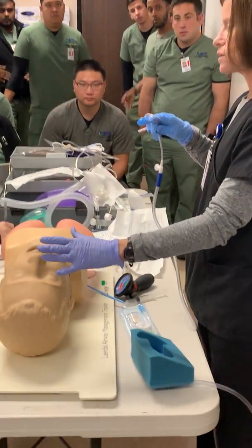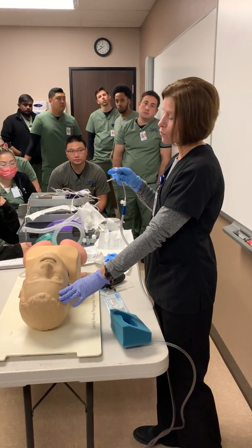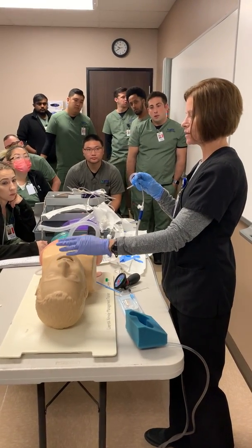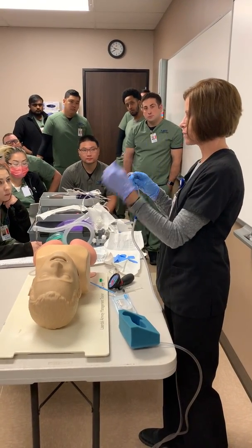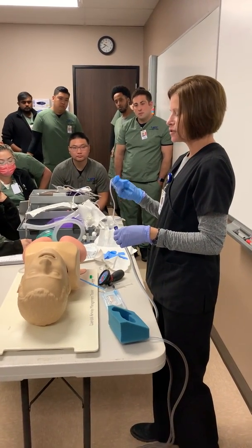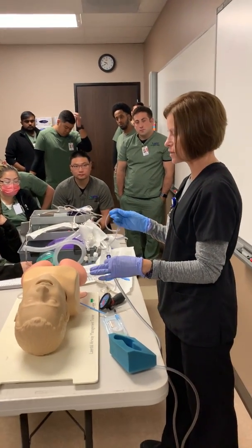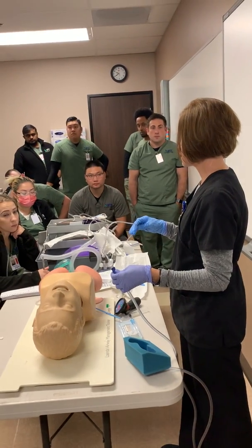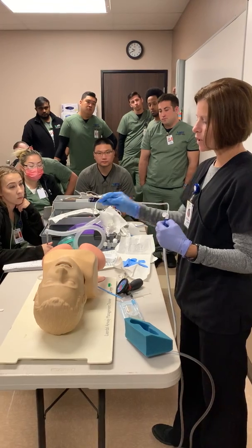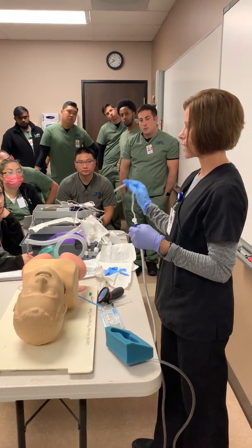Pre-oxygenation. So in the ICU, a lot of times they do the bag, the ambu bag. On the floors, a lot of times we don't. If a patient's wearing a nasal cannula, you'll see them put the nasal cannula in their mouth so that they're still getting some oxygen. Should you have an ambu bag, if it's somebody who you know has been sick or has a problem with oxygenation, then yes. But is it something you're going to see all the time? Unfortunately, no. If I was suctioning and all of a sudden I hit the cheek, this is a dirty catheter, I have to get a new one.